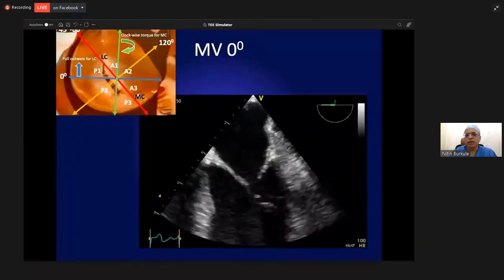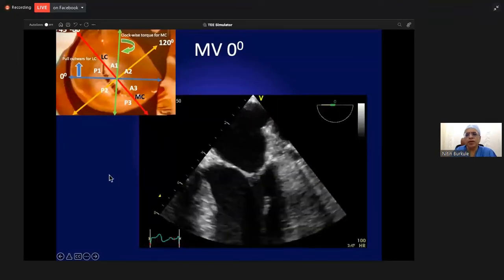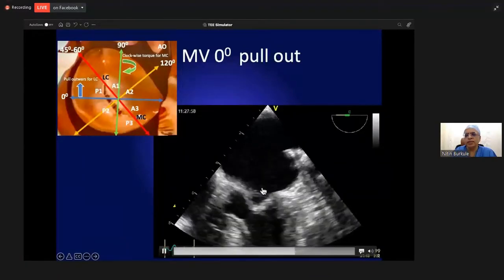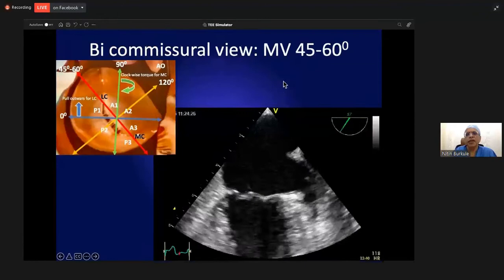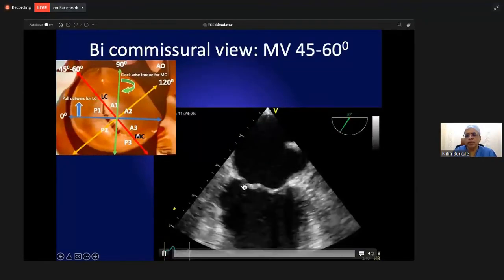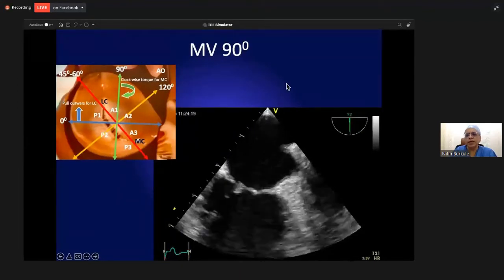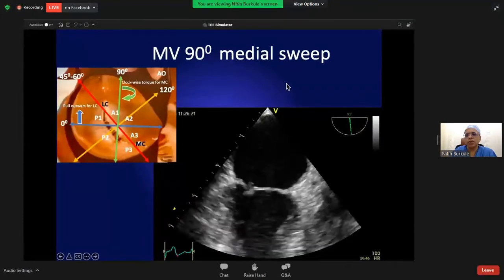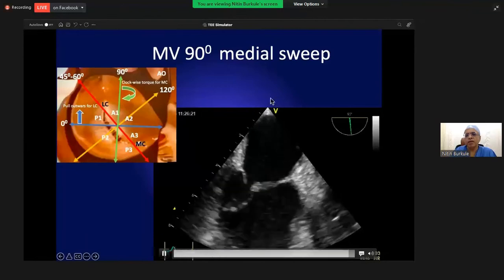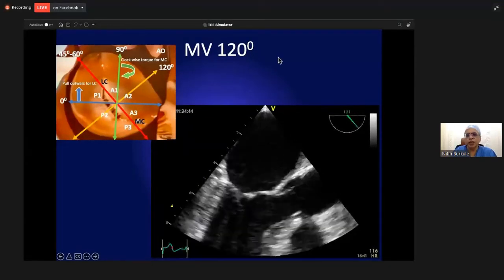There is a 0 degree view which shows your P2 and the A2 here, but just pull it out. And when you open up the LVOT, you see the P1 and the A1. You go on a 60 degree view and you have the bicommissural view, which shows you P1 here, P3 here, and the A2 in the center. And then you go to 90 degrees, and from 90 degrees, you just rotate medially and you see a good amount of P3 and a part of A3. And then you go to 120 degrees and you see A2 and P2.